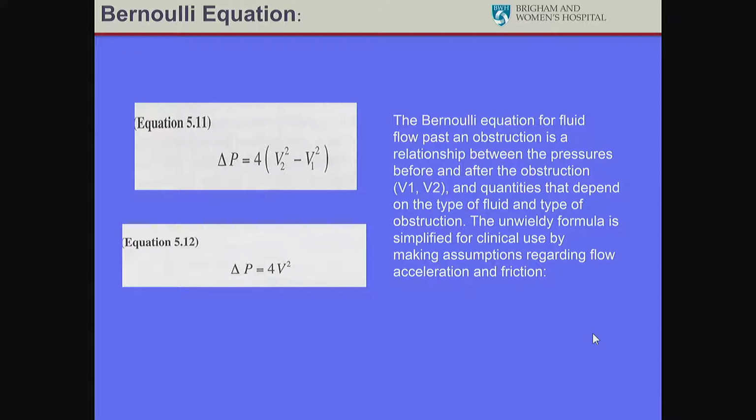Now I want to switch gears a little and talk to you just a little bit about the types of echo Doppler equations that you may encounter on the ABIM initial certification as well as maintenance of certification exam. So both the initial certification and recertification exam will not heavily test ultrasound physics. However, a working knowledge of both the Bernoulli equation as well as the continuity equation is definitely going to be tested.